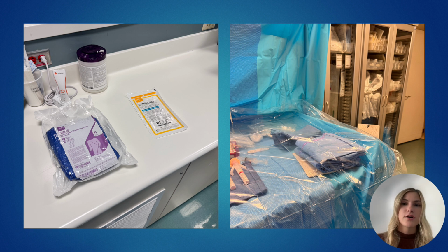Another action we took was using a separate package of gowns and gloves on a separate table to prevent contamination of the sterile cart. We also contacted the makers of the sterile packs to change the packs to include a separately packed gown to conserve space and to also serve as a reminder. As you can see on the right, the packs would typically come with unpacked gowns, one for the technologist and the other for the doctor.